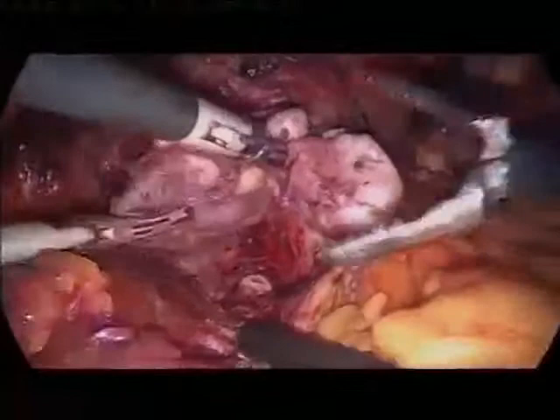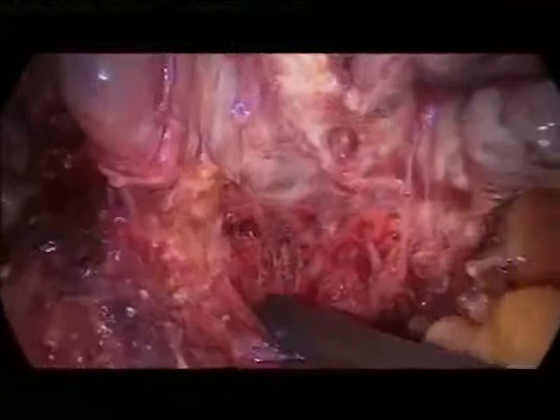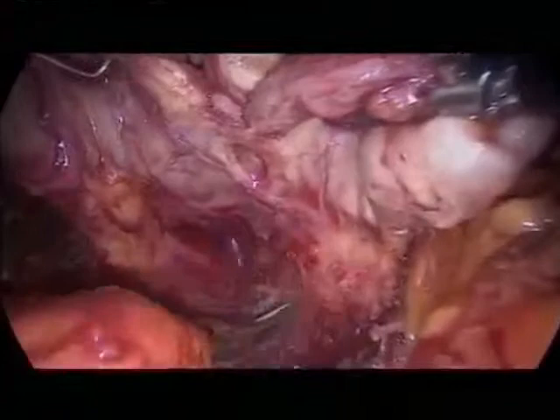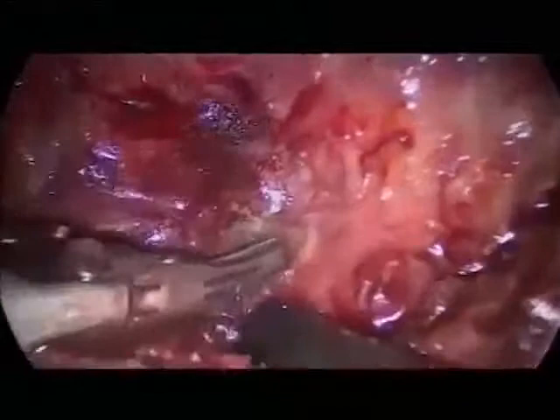Okay, come in. Push it here down. Tiefer. Okay. I would like to show you, when I incise here, we will immediately see the yellow color. Can you see this? Yes. Here, this is the pre-rectal fatty tissue. Yes. This is Denonvilliers' fascia.